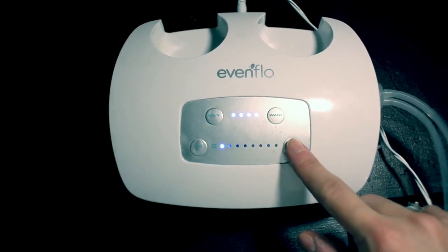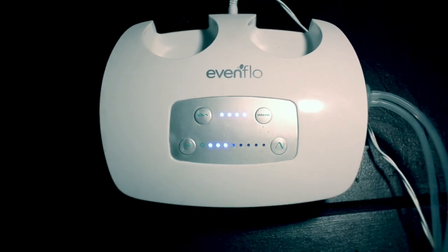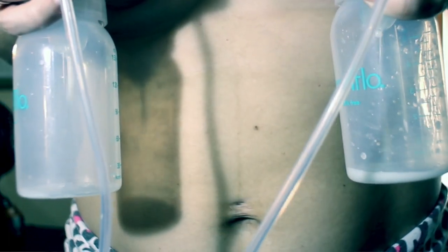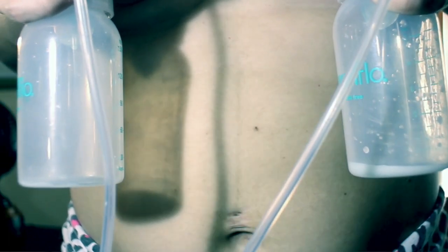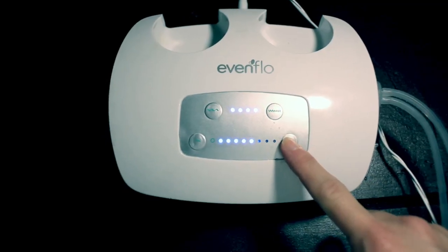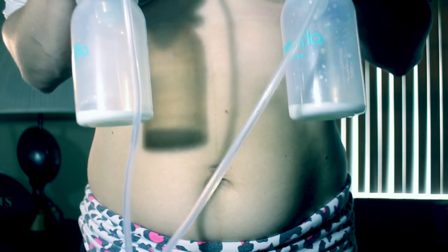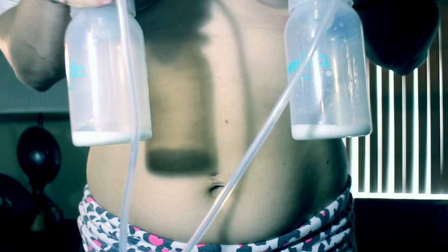How I like to start is I put the speed all the way up and put the strength to about a three. I wait for my let-down, which may take a few minutes. Once it starts flowing you'll see the milk come down. Once my nipples get used to that suction, I increase it about three more.